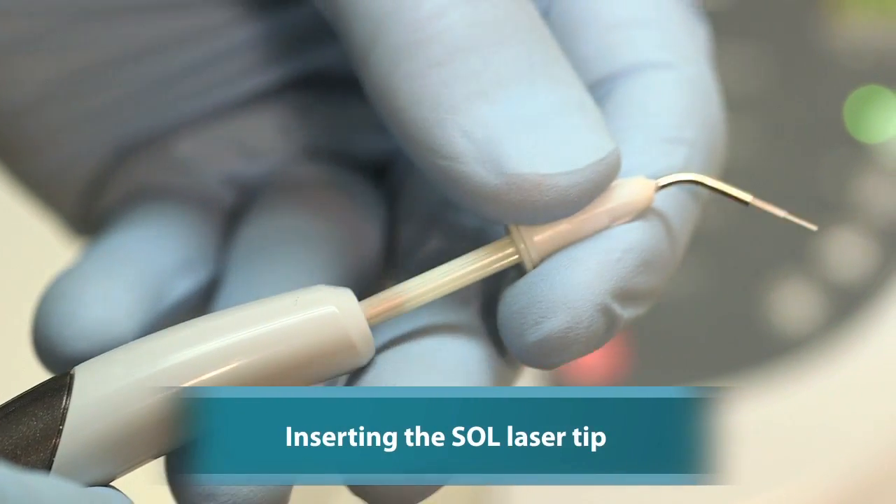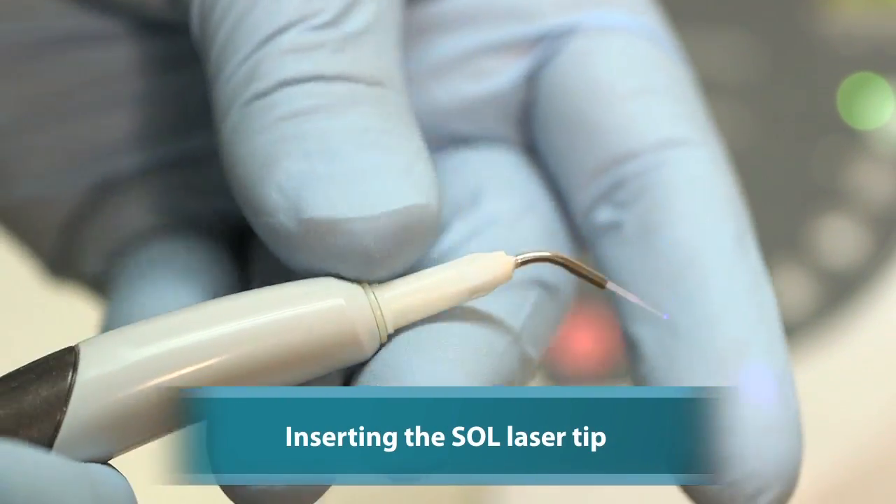Anytime we do surgery, we have a few different options: we could use a scalpel, an electrosurge, or a laser. The reason I like a laser for surgery cases such as a frenectomy is that I have no blood in the field, I don't have to use any stitches, and you don't get the charring effect that you get with electrosurge.